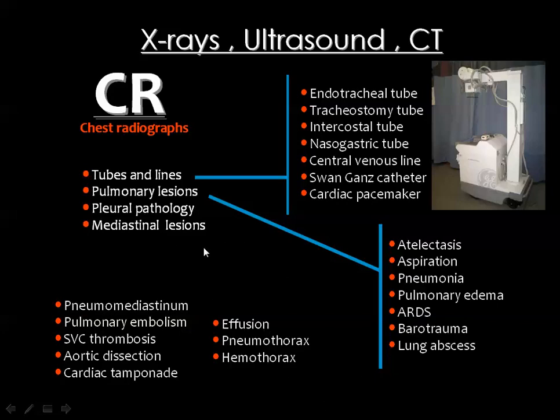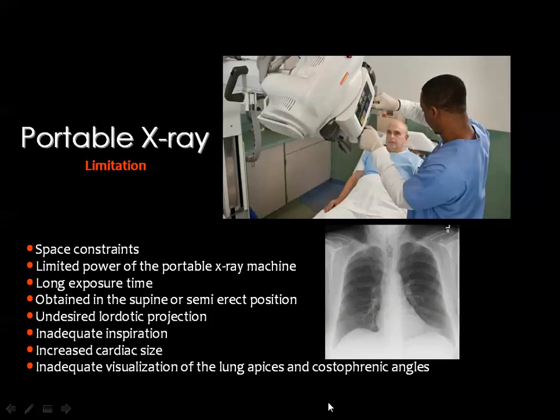And also we'll have some words about the mediastinal pathology, including pulmonary embolism, superior vena cava thrombosis, aortic dissection, and cardiac tamponade.